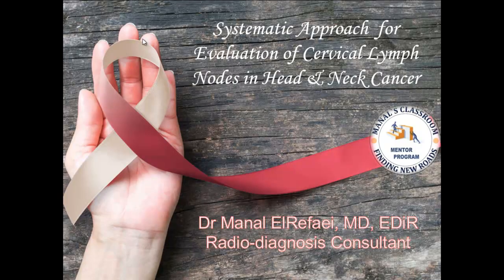We are going to discuss the systematic approach for evaluation of cervical lymph nodes in head and neck cancer.